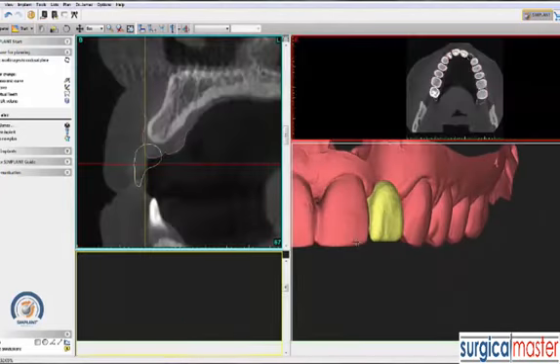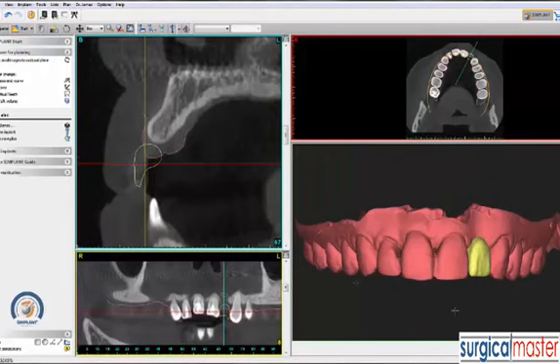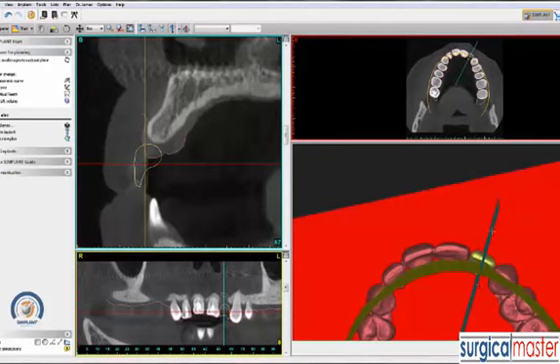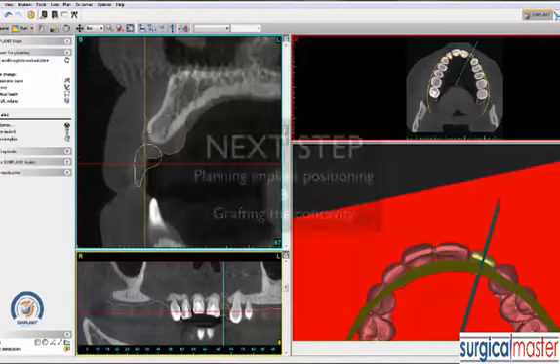Next, we pick a section that goes through the virtual wax-up, and we are right there. We look at the cross-section on the upper left and can see the cross-section of the tooth. We can see the soft tissue here in pink, the bone, and the concavity as well.